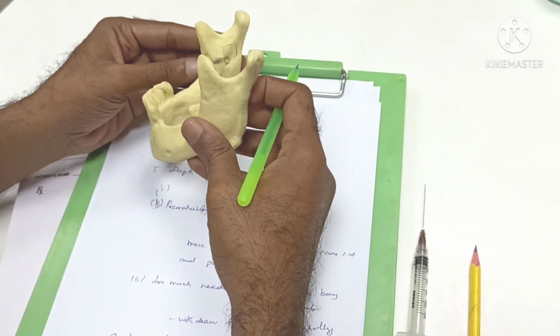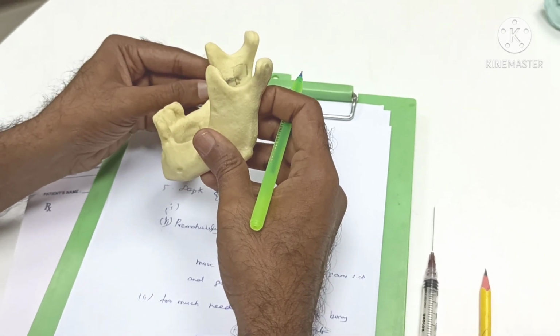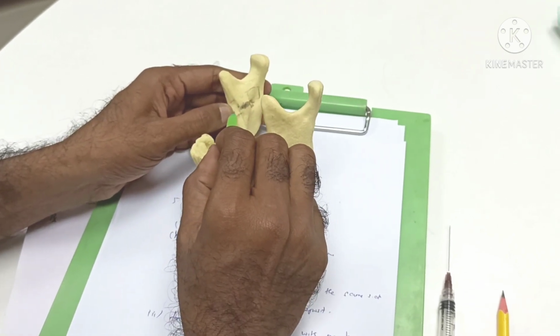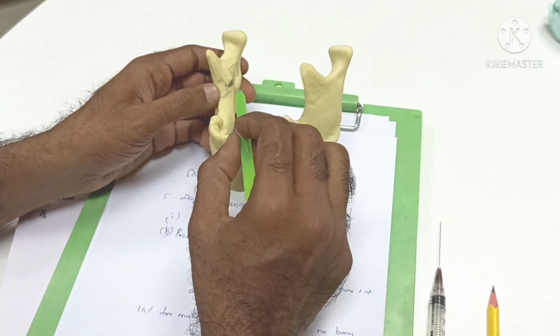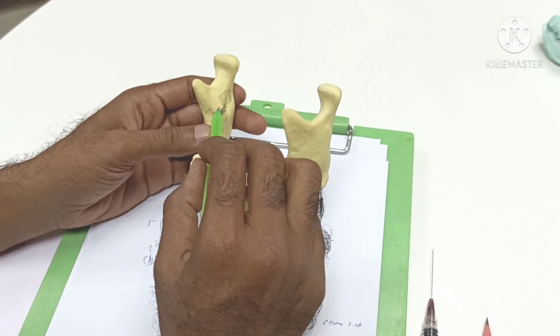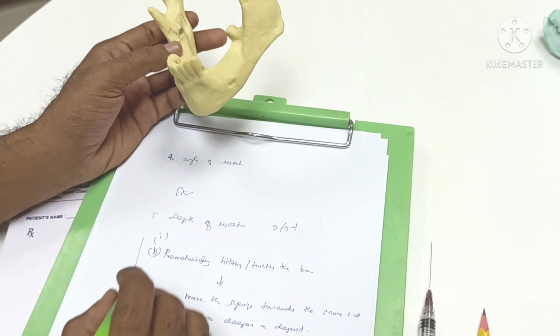So the theoretical technique is you have to palpate this coronoid notch, this deepest notch, with your finger, and your depth of insertion should be the middle finger. But you don't have to follow these things. Just remember this rule: above the occlusion plane, about 6 to 10 mm, anywhere you can start and you can go deeper. You just have to follow these two possibilities.